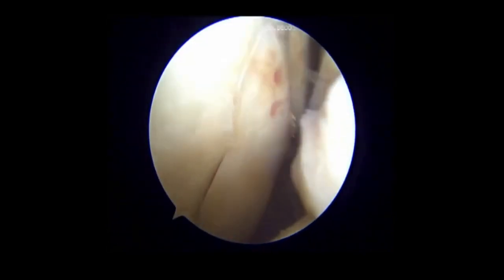The knee is now moved to figure of 4 position to visualize and enter the posterolateral compartment for the removal of the mucoid tissue.